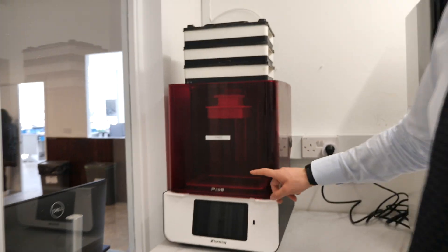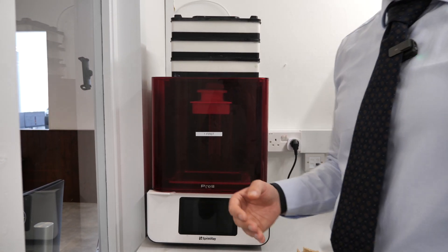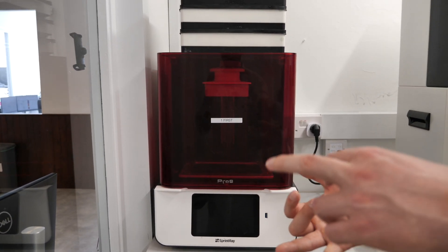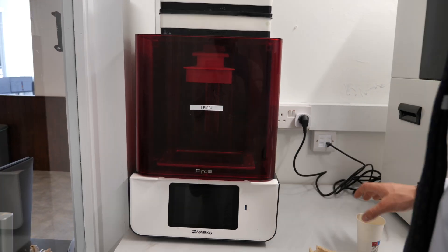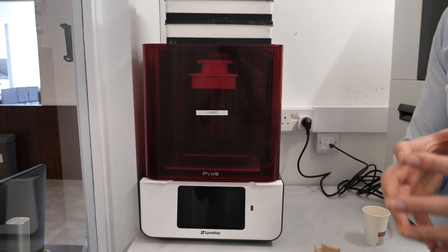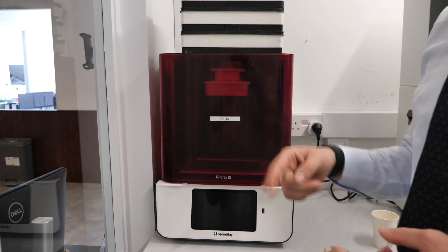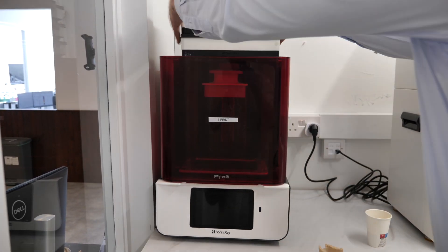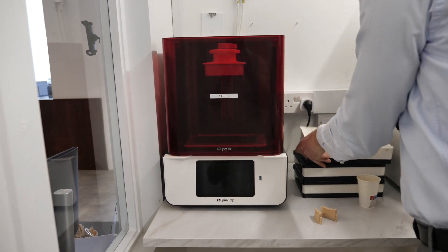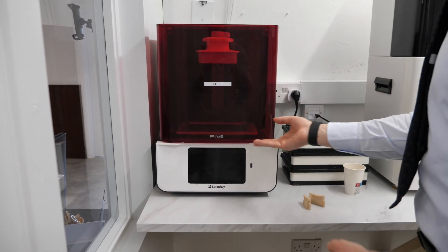This is the SprintRay Pro 55S. Their old generation of printers were called the Moonray — those are obsolete. They now do the Pro 55S and Pro 95S, determined by resolution. A printer, just like a screen, has pixels and the fine granular detail is determined by resolution. This is 55 microns in the XY axis. Here's the build plate, and these are the resin tanks where we pour the resins.